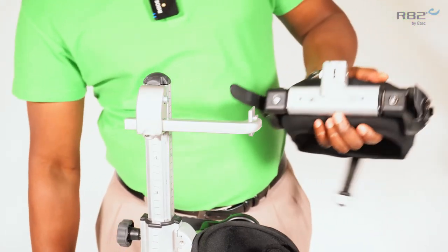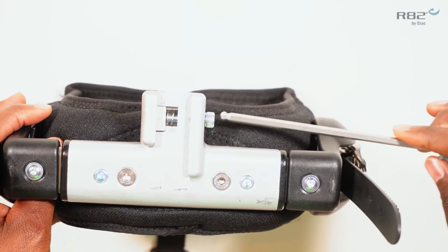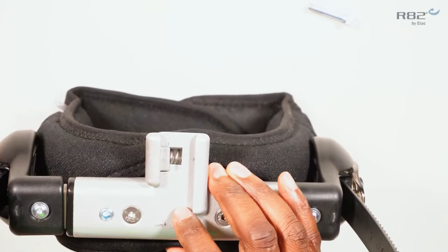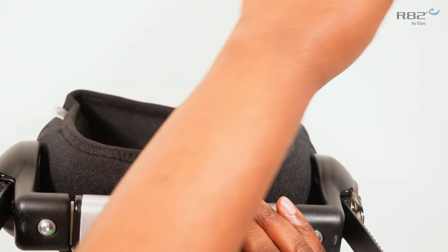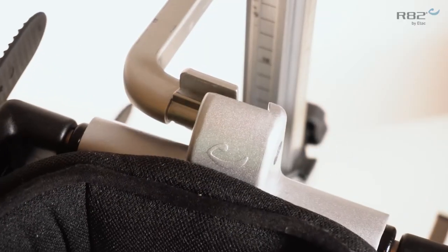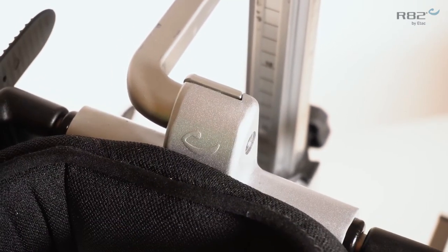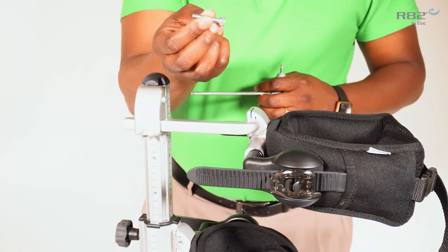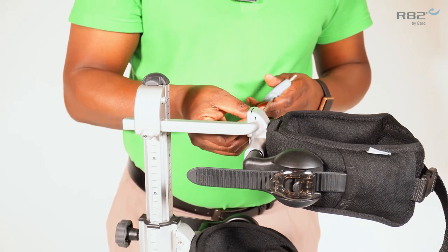The next step is to remove the inner guide from the mounting support of your trunk support. Once you have removed your mounting guide, your trunk support will slide onto the front of the displacement kit. Remember to reinsert your bolt to secure the trunk support.